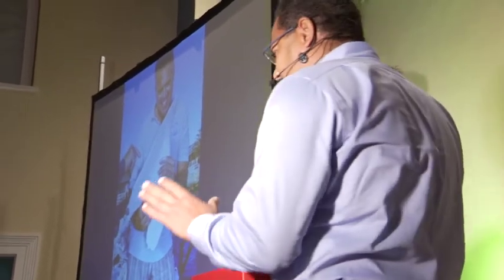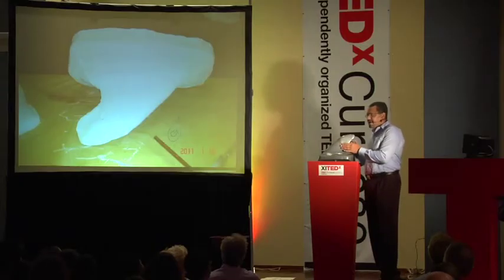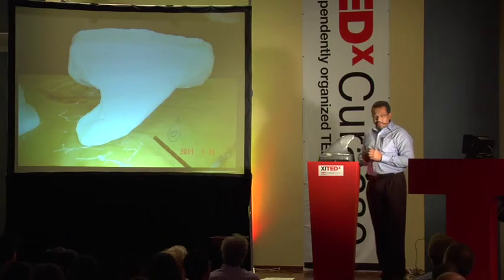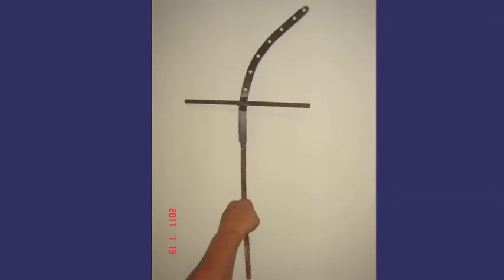And you can see, this is the veterinarian, how happy he was that so far so good. And here you see the negative. This is the shape, prepared to pour plaster in. Now, you might know that it's getting very thin to the back. So we had to use a mixture of special plaster, also a kind of plaster that is normally used in the fabrication of teeth, to make it strong while still thin. And we had to weld a special reinforcement to go inside the mold.